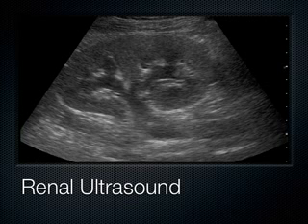For example, when the urine tries to make itself out the ureter, if the ureter is obstructed by a kidney stone, the kidney can't really expand, and so that's what causes such terrible colicky pain. So that thick capsule is out here. This is all the cortex of the kidney here. We can see the cortex all the way around here. And this is the sinus or pelvis of the kidney, this hypoechoic or anechoic area. Recall that hyperechoic means bright, hypoechoic means dark, and anechoic means black.